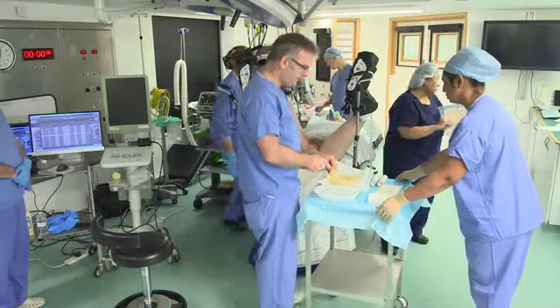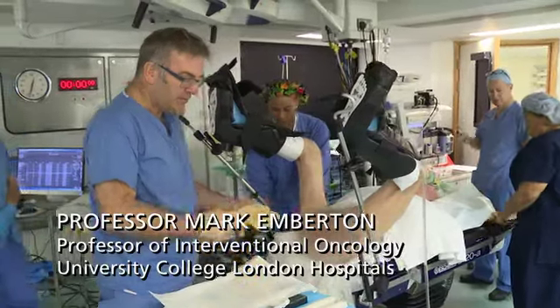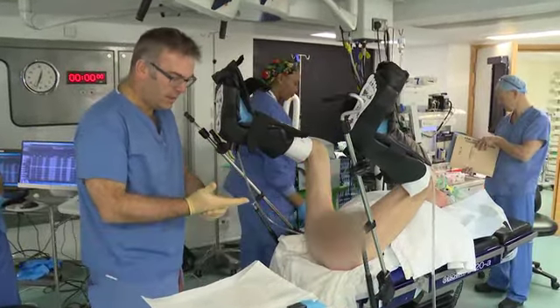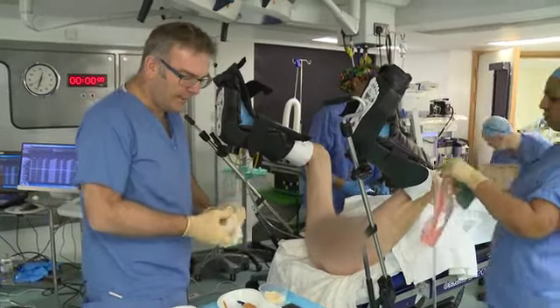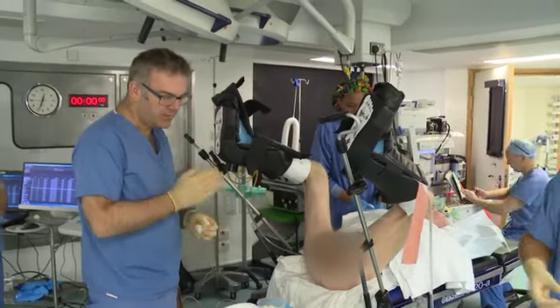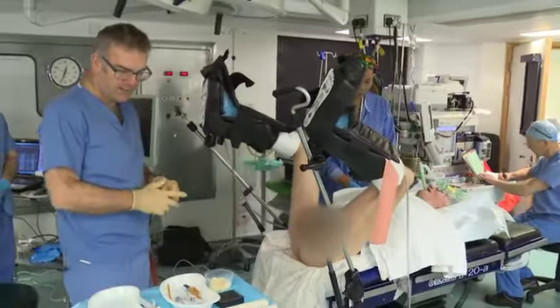So this is a challenging case. This is a man who had radiotherapy some time ago which recurred, and he had focal salvage cryotherapy to the right-hand side of the prostate, and I think he's got a recurrence just to the medial aspect of that, so between the right lobe and the midline anteriorly.